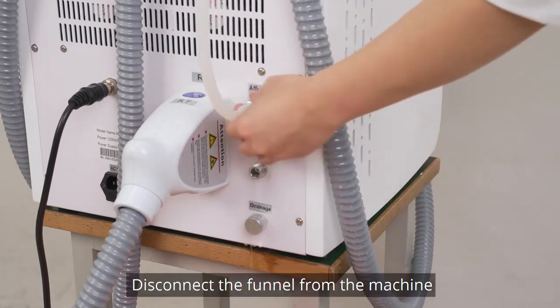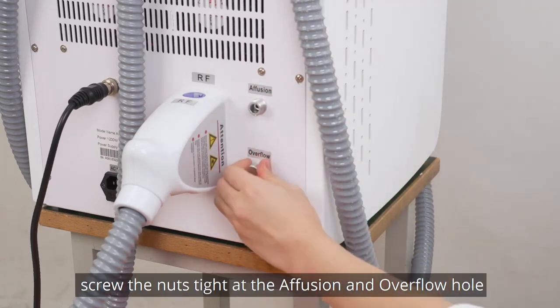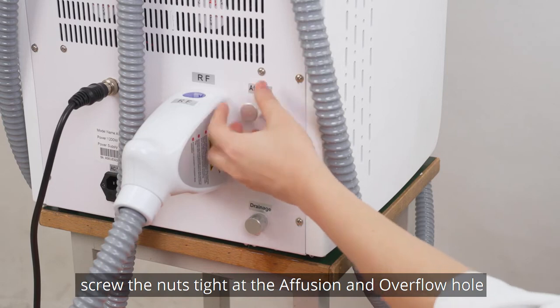Disconnect the funnel from the machine. When there is no water coming out from the overflow, screw the nuts tight at the infusion and overflow holes.